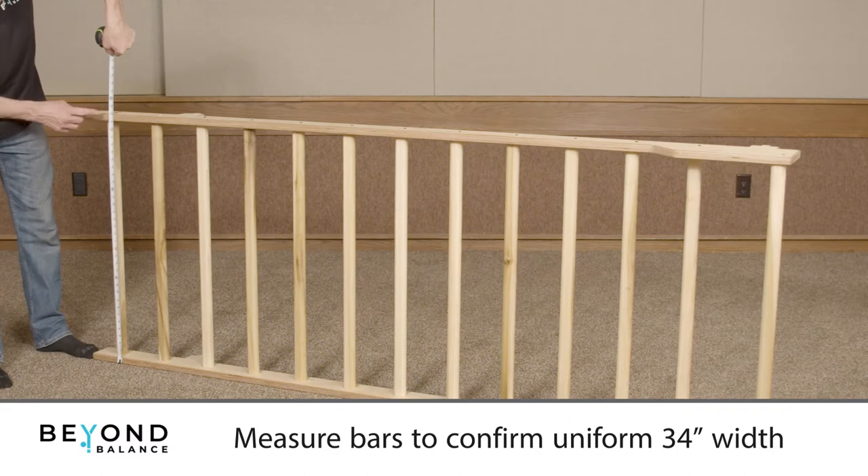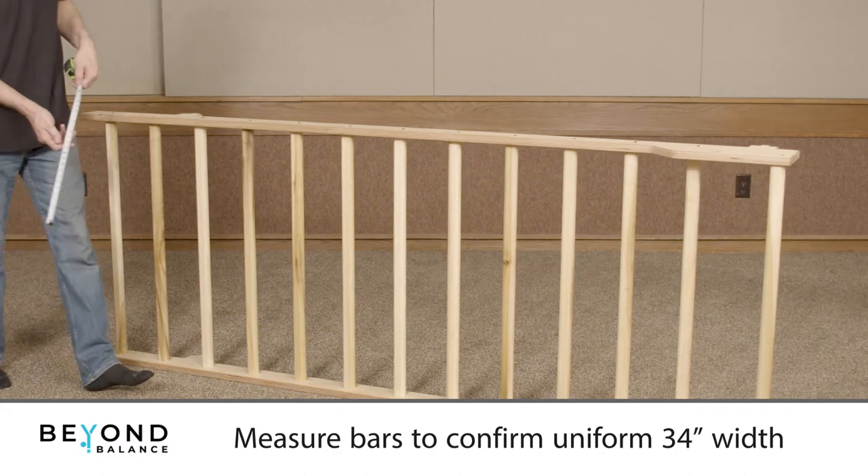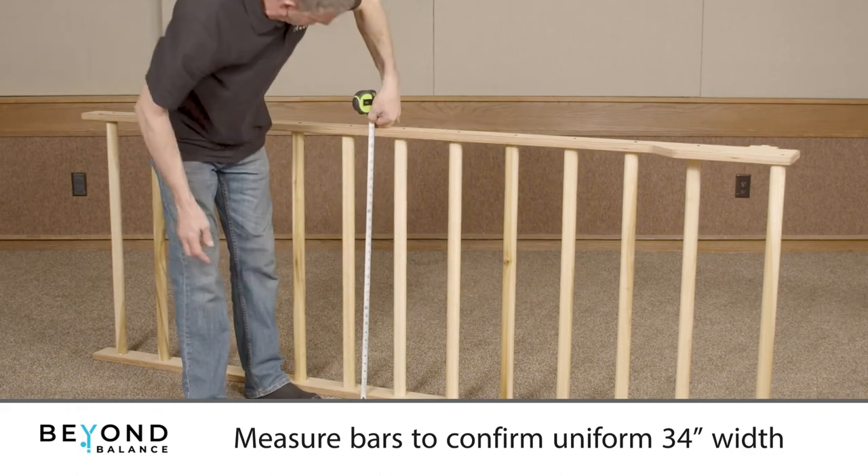Measure the width of the bars at top, center, and bottom to confirm a uniform width of 34 inches.